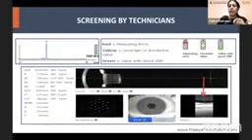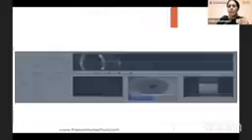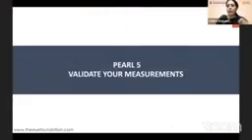You need to teach your technicians to look at all the LED points, whether it has a fishtail appearance, whether it's in the red or yellow or green, whether the standard deviation was less than 0.2, whether the signal to noise ratio was more than 2. These are small issues which become big issues when you're looking at exactitude in emmetropic outcome. So you need to validate your measurements.